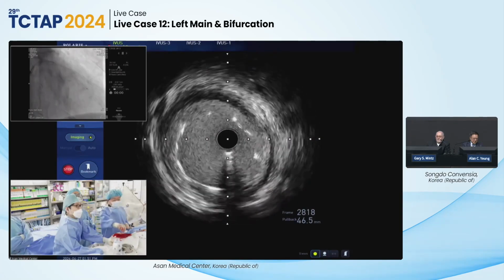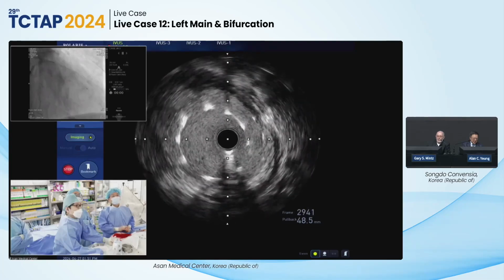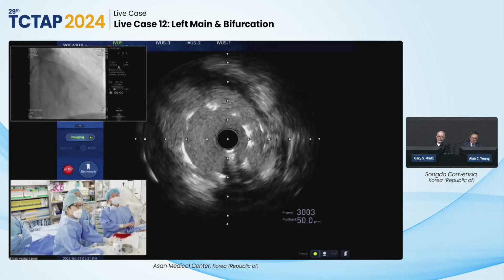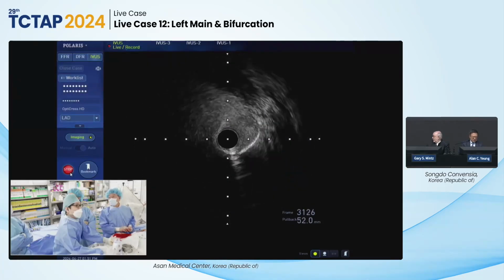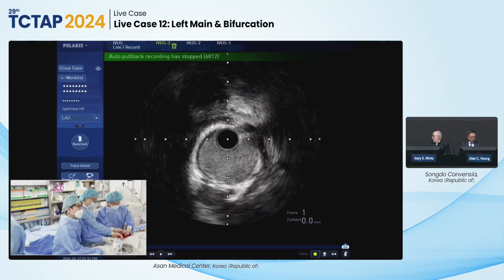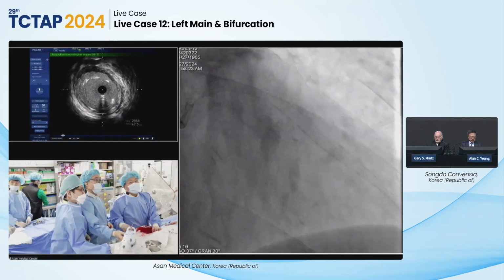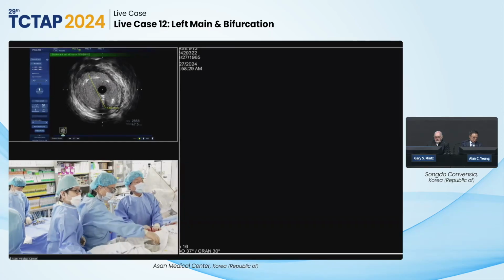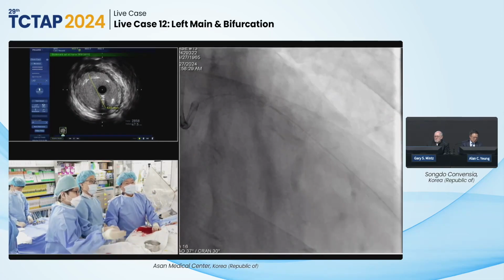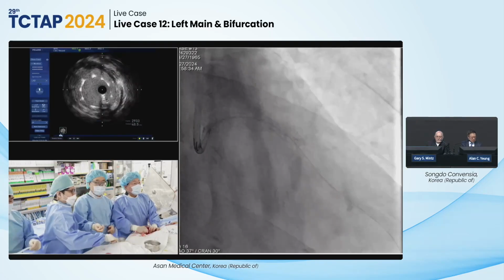The very proximal struts that you see there are malapposed. Oh, this is a lot malapposed. We need a four. Yeah, four, bigger NC 4. Okay, 4. Actually, the clinical outcome concern with a big vessel and a little bit of malposition, I think it's not a big deal, right? However, yeah, we're going to do additional dilation.